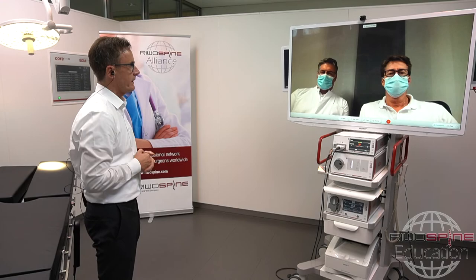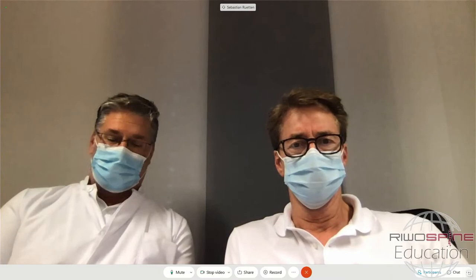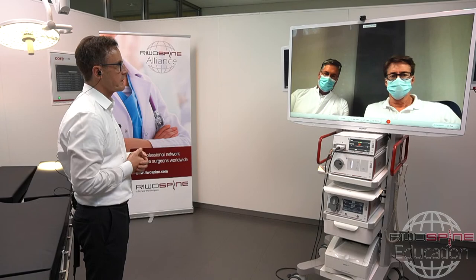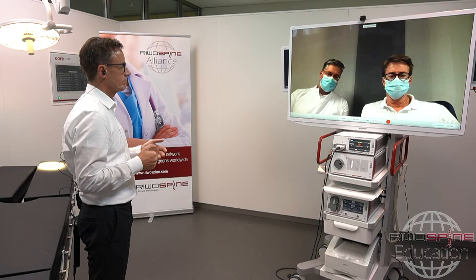Well, we don't have much experience, but of course we have a lot of experience with using radio frequency and laser at the lumbar spine. But when we are talking about endoscopic procedures, we're focusing on intraspinal located problems, and we want to visualize them. Of course, we use intraoperative radio frequency. But I think you cannot draw a line or do a comparison between an intradiscal therapy, either with laser or other methods, and an endoscopic procedure. So I cannot answer this question as the person may like. In general, you can do the same things with a radio frequency probe under continuous visualization. Of course, the possibilities are there, but you use the endoscope to have the visualization. Okay, thank you very much.